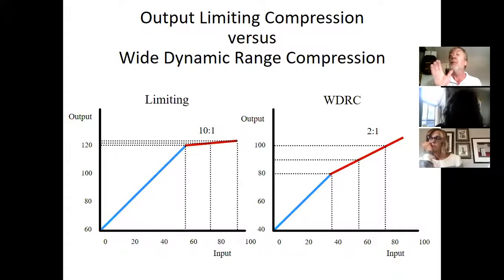The point is this. You've set the hearing aid strength with the hearing aid software. You've gone into NOAH. You've entered the guy's audiogram. You've chosen, let's say, Phonak or Oticon. Then you went in and chose the model of the hearing aid, and then you hit set. And the software sets the hearing aid. And the input-output function might look like this.